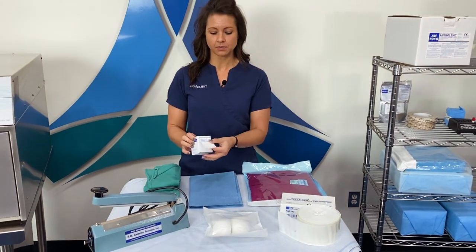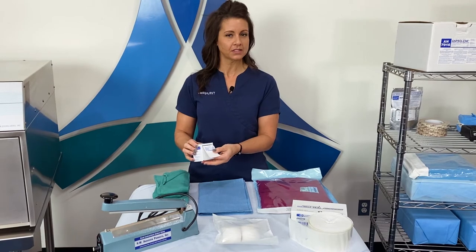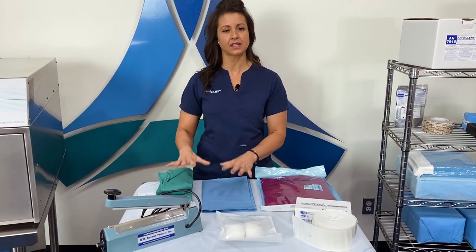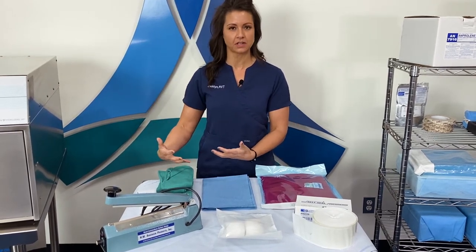Also consider the exposure indicators for the inside of these packs that a lot of people like to utilize. Your doctor likes to see some kind of indicator on the inside of their packs to give them that assurance that this pack has been sterilized.